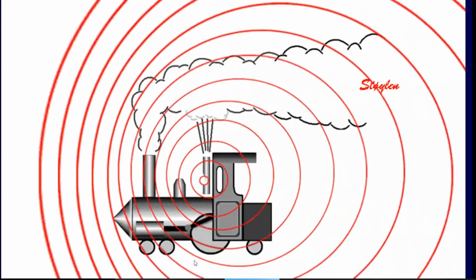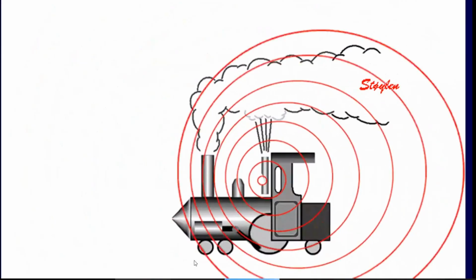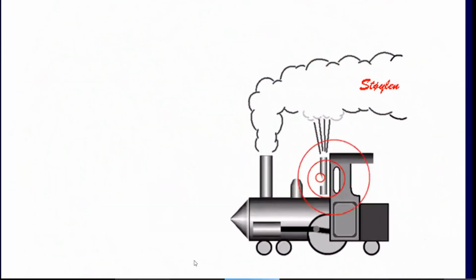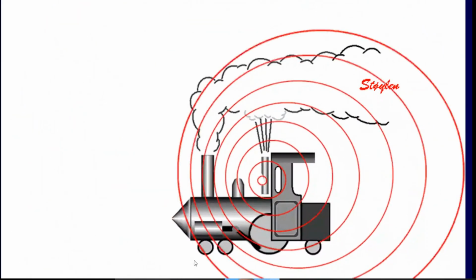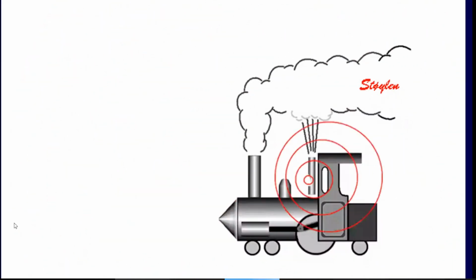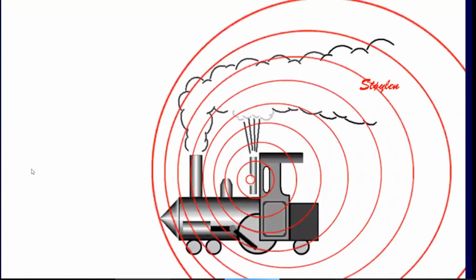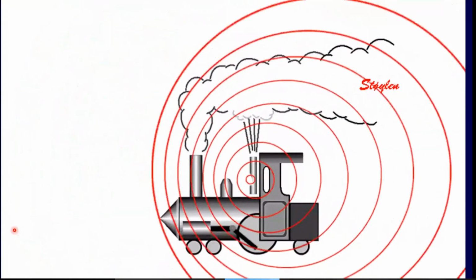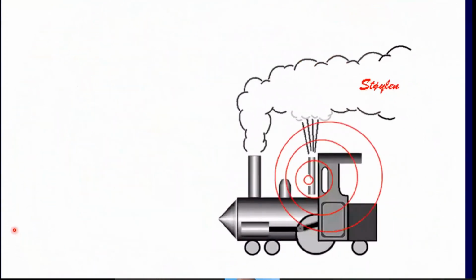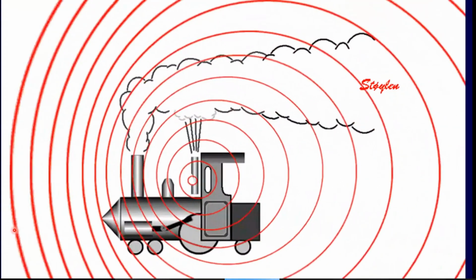And when you talk about the Doppler effect, we have to know about the Doppler shift. That is when you have a moving object which is coming closer to the transducer, the mechanism of sensing that object coming near to it.